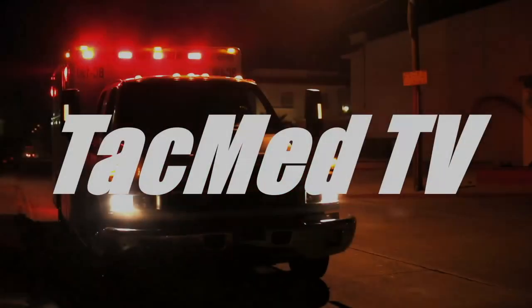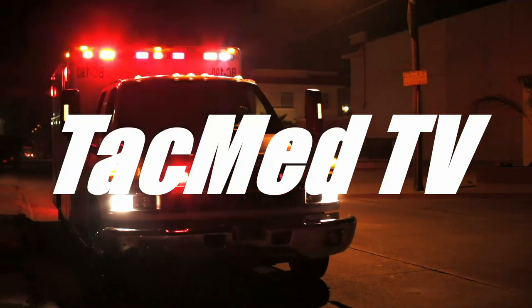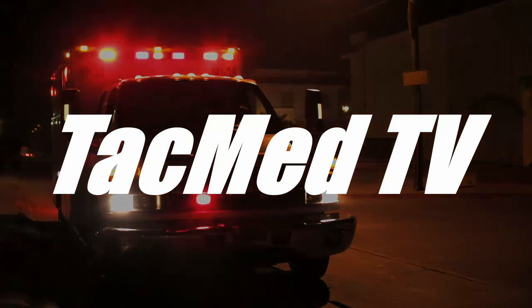The Soft Tee Wide Tourniquet, today on TacMed TV. Steve here with TacMed TV. I'm going to talk to you a little bit today about the Soft Tee Wide Tourniquet — the Special Operations Forces Tactical Tourniquet Wide — made by a company called Tactical Medical Solutions.